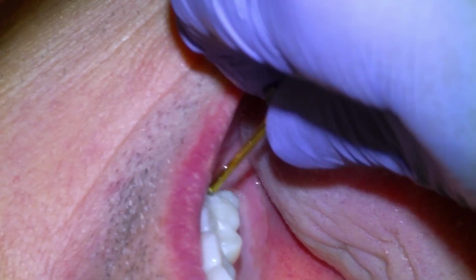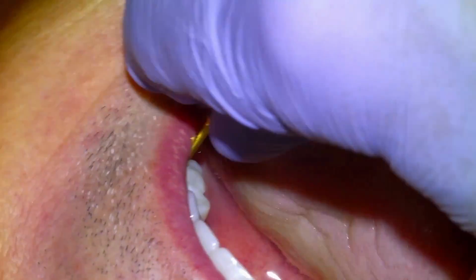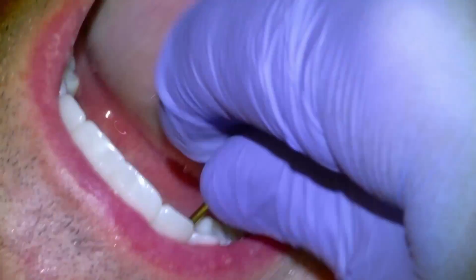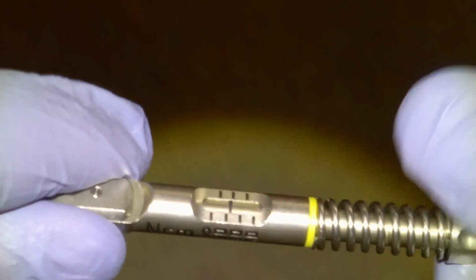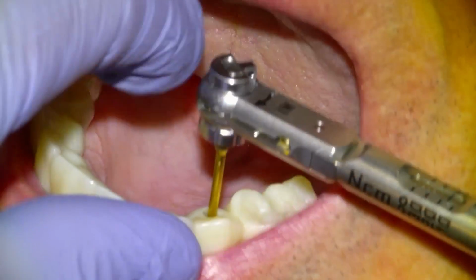screwing down the screws. By the way, this is a procedure that I usually don't even need to freeze for. I think we may have frozen a couple spots that were pinching, but I use these, they're called tissue level implants, that I'm a huge fan of. The literature that I've read says that they retain the bone around the implant better than their bone level counterparts.